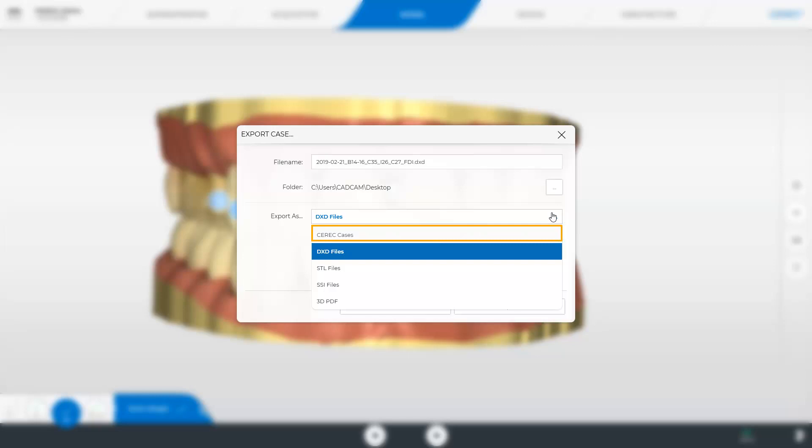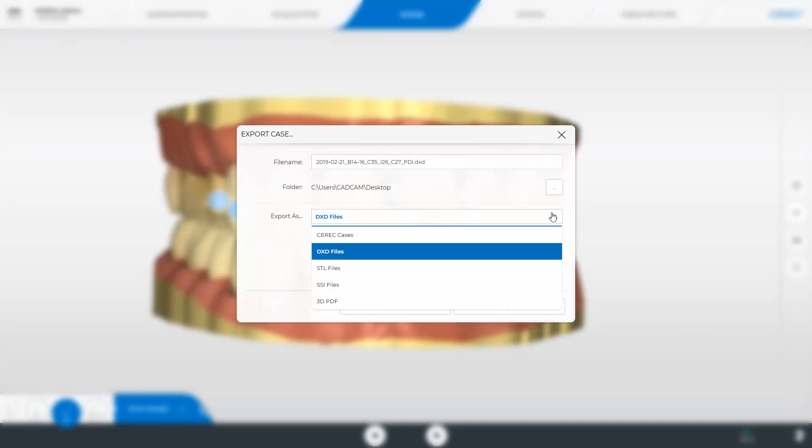With the first option the model data will still be exported as an RST file which can be used for importing into a different CEREC software with the same version number or higher. The export in DXD format is specifically suited for import into the in lab CAD software and transmits in addition to the model data the preparation margin determined by the dentist. The third export option is an STL file.